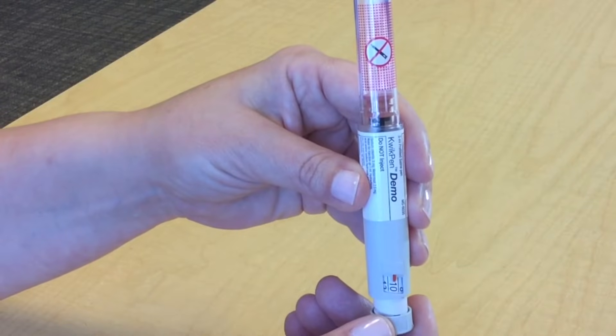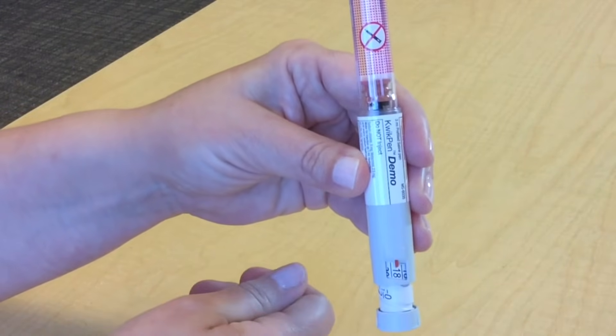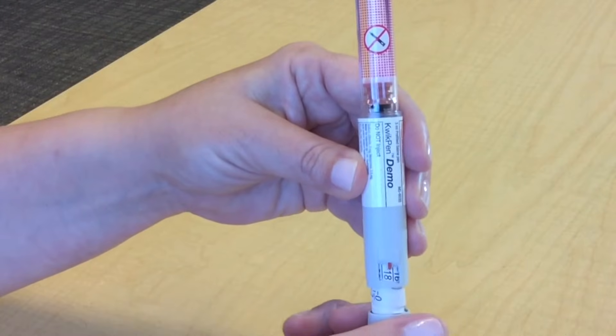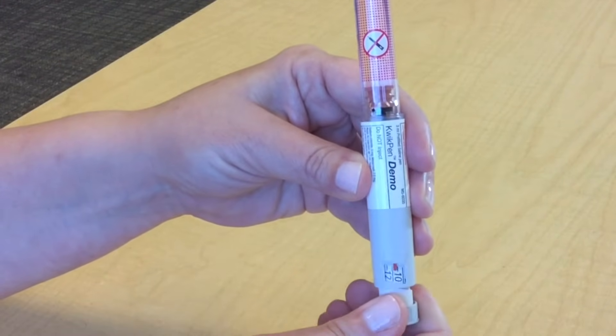If you accidentally turn the knob too far, say like that, it's okay. You can just turn it back to the dose that you need, and in this case, 10.